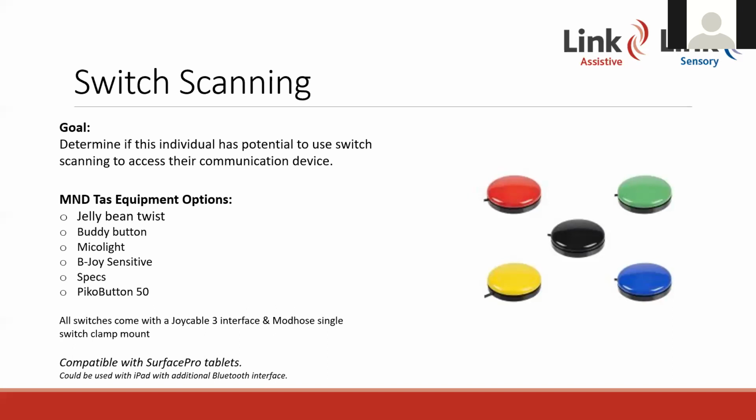From a practical perspective, all the switches from the MND TAS loan pool come with a joy cable interface and a switch clamp mount. The clamp mount gives you lots of flexibility with where you put the switch, and the joy cable enables you to use the switches with the Surface Pro tablets.